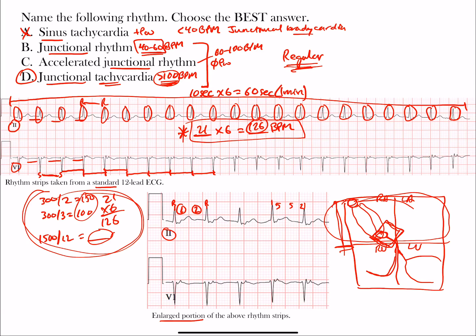You see these QRS complexes because P waves, which are atrial depolarization waves, aren't conducting through. Notice these are narrow complexes, another thing you see with junctional rhythms - regular narrow complexes, especially if coming from higher up. As it gets lower, you'll see wider complexes. With ventricular rhythms, you see wide QRS complexes from slow cell-to-cell depolarization.